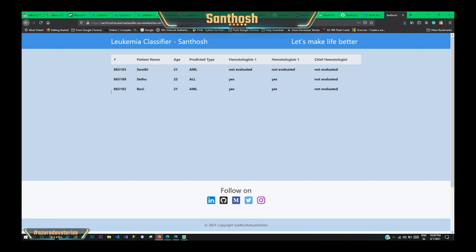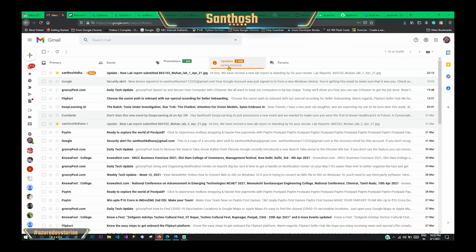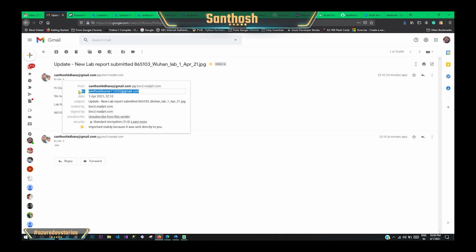So let me just quickly update it. Okay. So let's say both the hematologists say yes. Let me just show you the mailer that is sent. So if you can see, this is the mail that was sent to myself, and this is my other mail ID.